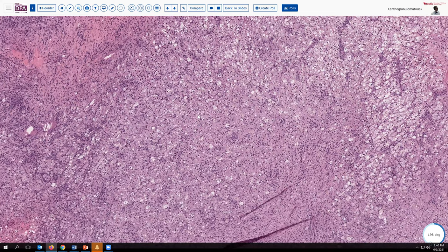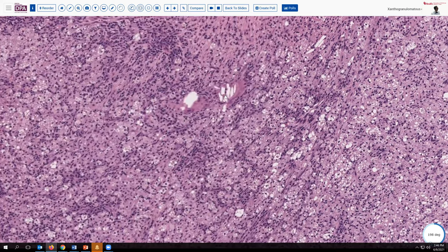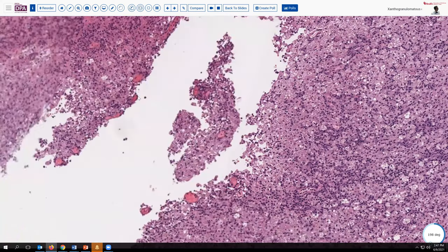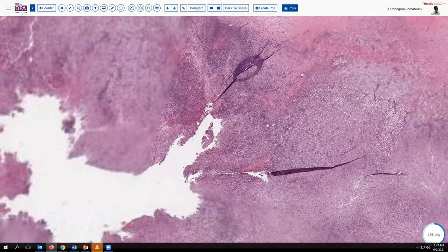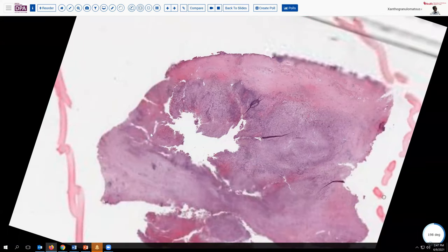And this is something that goes by the term of xanthogranulomatous cholecystitis. Xanthoma, of course, referring to the foamy cells, and occasionally we'll see little foreign body reactive cells. Like here, we have some multinucleate giant cells with obvious crystal ghost remnants remaining in the cytoplasm where they have engulfed cholesterol crystals. So xanthoma, a little bit of granulomatous reaction, explains the name. Neutrophils come along especially if there's been any disruption of the tissue, so we can occasionally see areas where there's been a breakdown of the tissue and more potential acute inflammation — almost an abscess type of thing, although it tends to be a sterile abscess type of process. So the wall is drastically thickened, not by neoplasm in this case, but by this very xanthomatous process that gives the impression of mural thickening and potentially a mural mass.